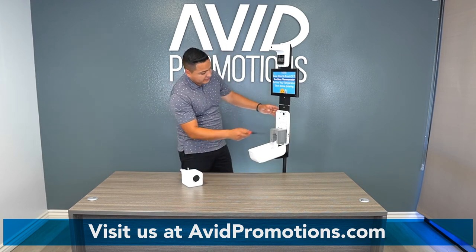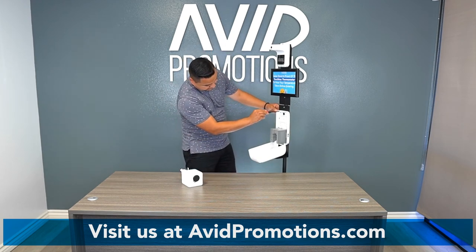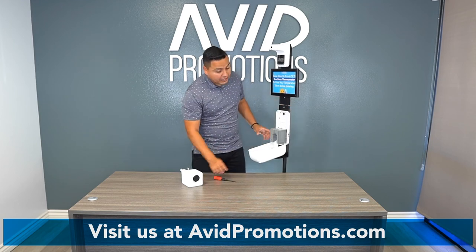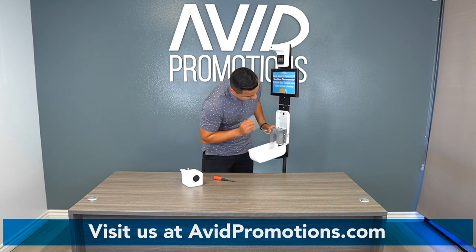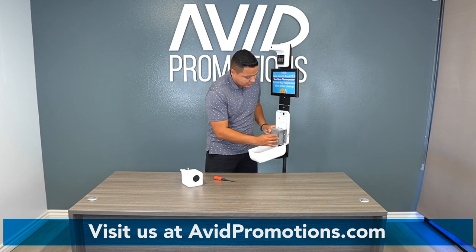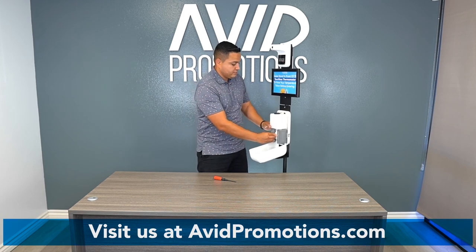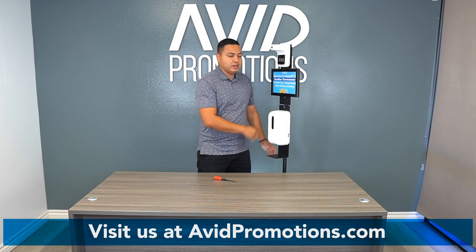Once it's in place, tighten it up. If you have the battery pack, open it up, insert your batteries, and close it. Then put the master card back in — it's all set to go. Lock it up.